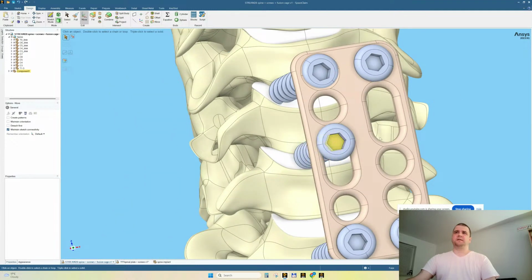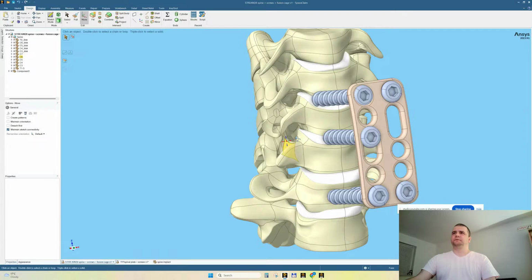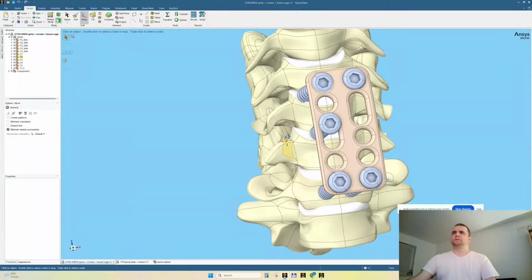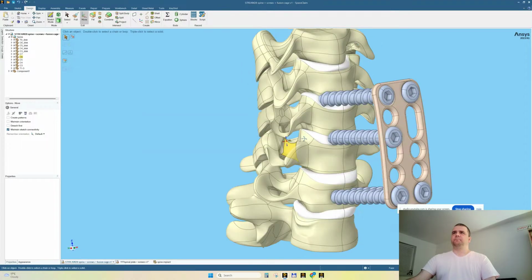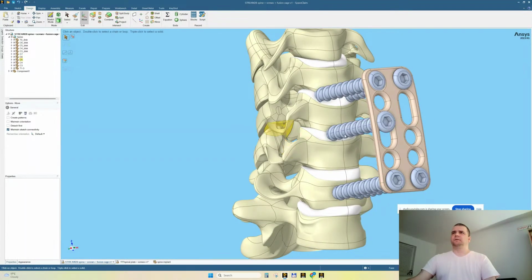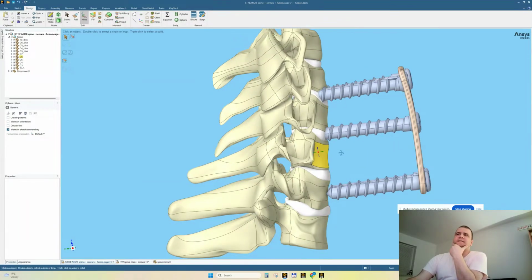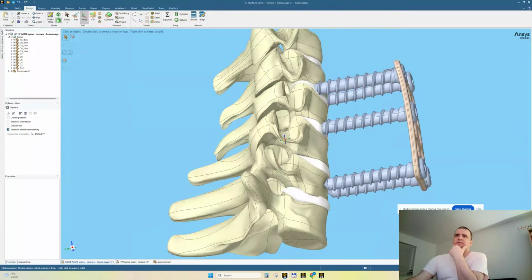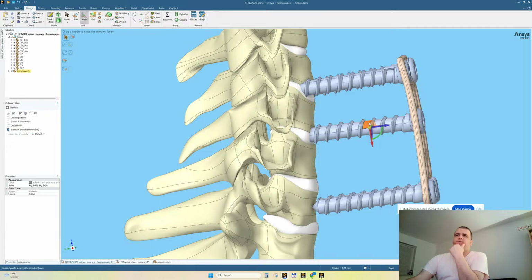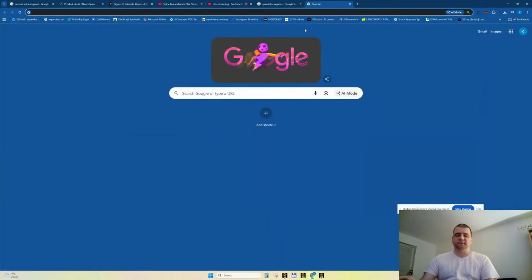But now I see that it's a little lateral, so maybe it's not the right design. Yeah, maybe my plate is not the best plate for this scenario. So what I would do is scale, because we can see it's too much. The screws are too big. Let's get a reading. For example, the diameter of the screw is 10, but let's ask for an average diameter of the screw.